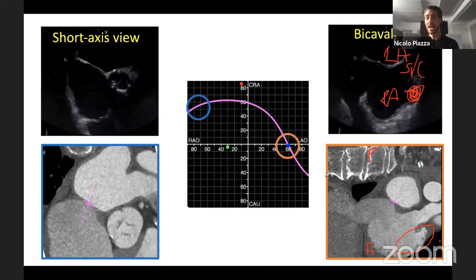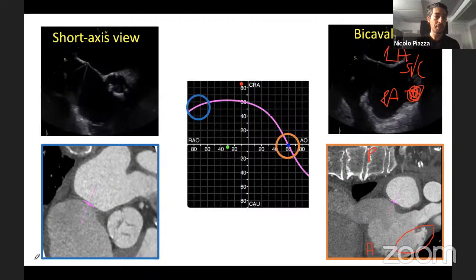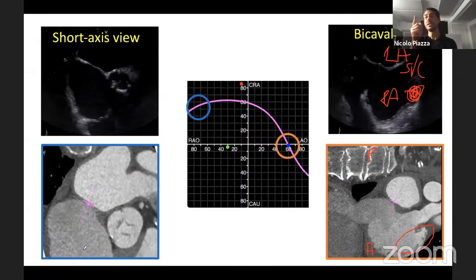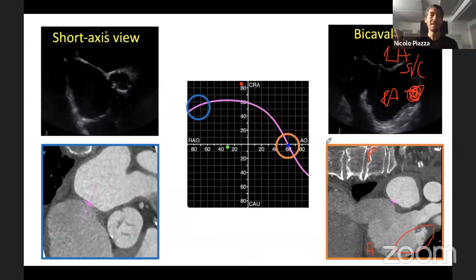Now, just a little anecdote, okay? It's something annoying sometimes, when you're advancing that wire from the IVC into the SVC to start your transseptal puncture, it seems always to buckle into the right atrium somewhere, and you're sort of going up and down, and hopefully by chance one time it's going to go into the SVC.